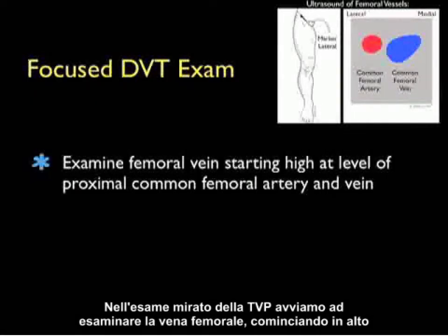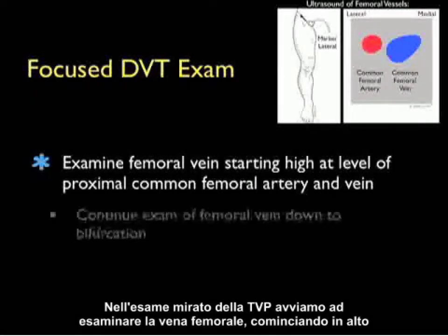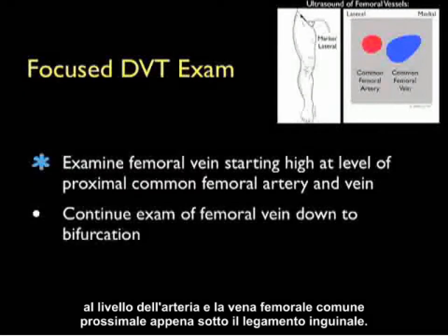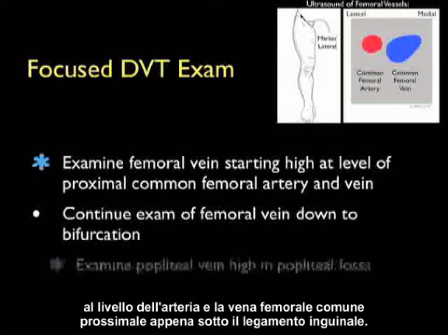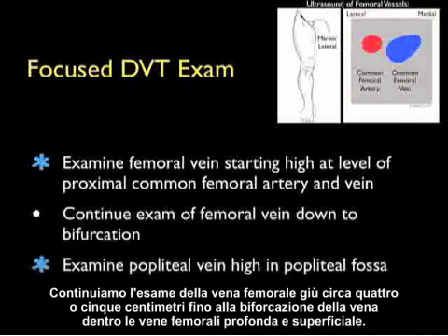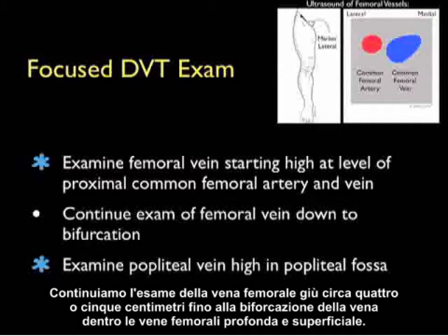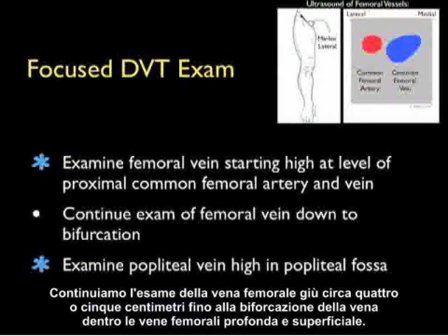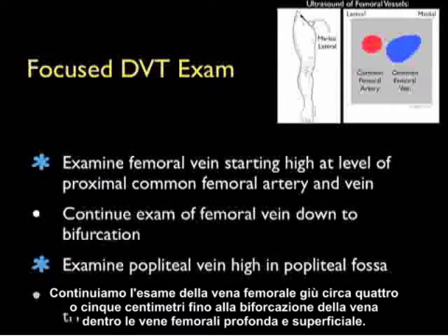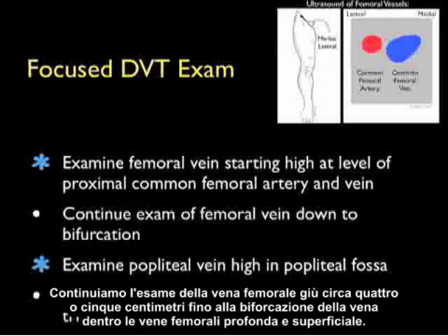In the focused DVT exam, we'll begin by examining the femoral vein starting high at the level of the proximal common femoral artery and vein just below the inguinal ligament. We'll continue the exam of the femoral vein down about four to five centimeters through to bifurcation of the vein into the deep and superficial femoral veins.